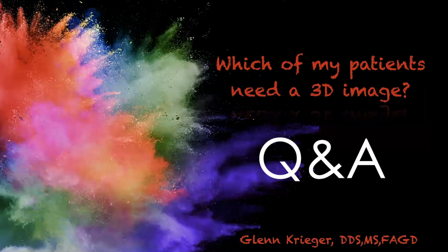Okay, then last question. Are you no longer taking cephs since every patient gets a 3D X-ray? Yeah, there's no reason to. Like I said, I use the ALARA technique, right? As little as necessary, as reasonably accessible, or I forget the last A. But at the end of the day, my CBCT allows me to pull out anything I need to see from it, within reason, for what I need for ortho.